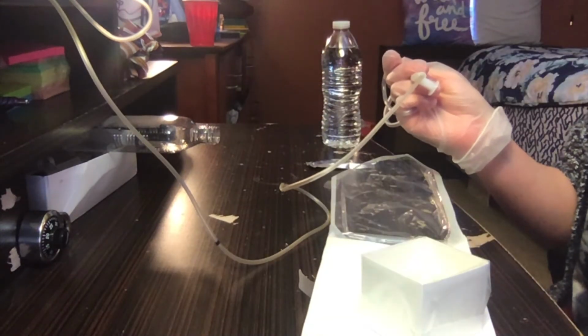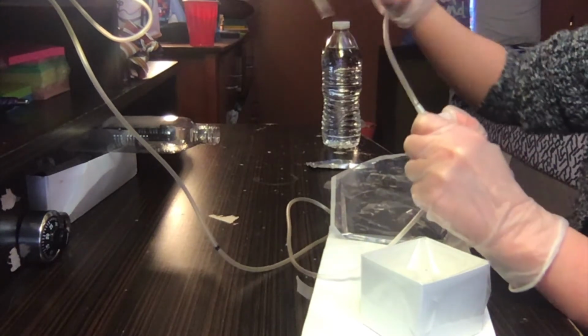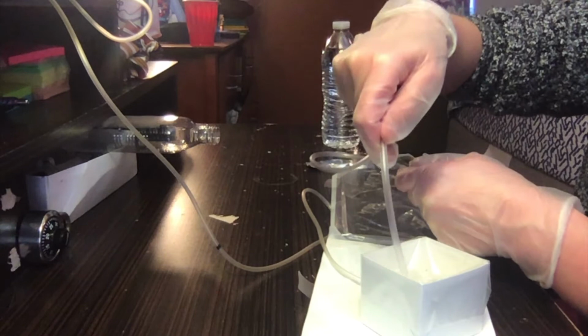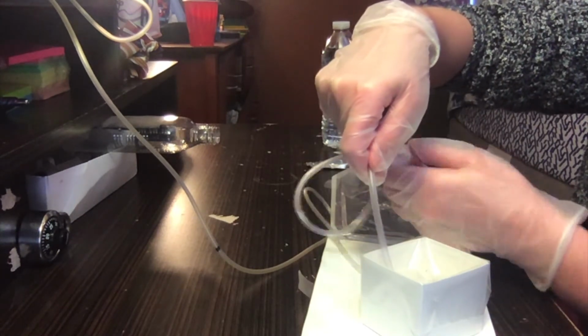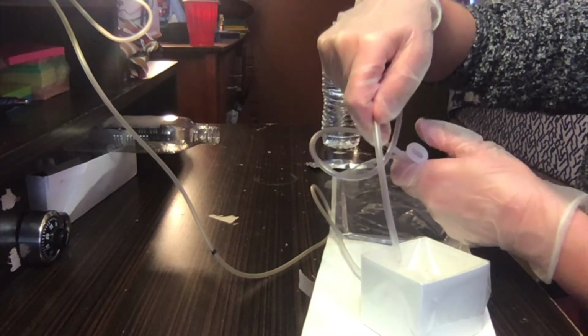Now that my tubing is connected, I'm going to check the suctioning level. So I'm going to take my tubing and dip it into the normal saline, and then I'm going to suction it by pressing the top here. And it is suctioning well.